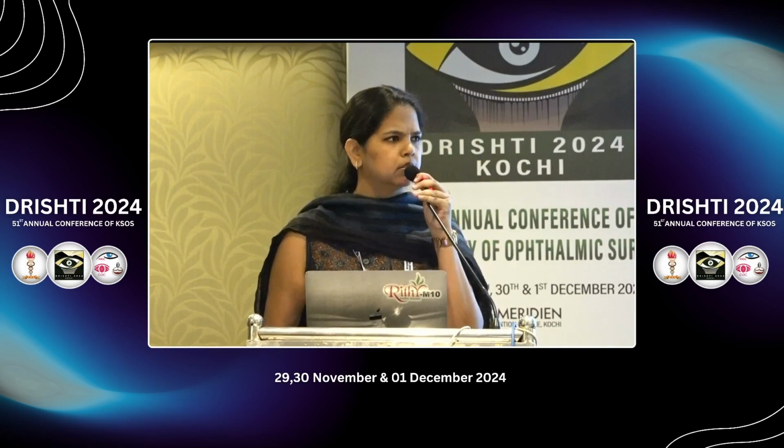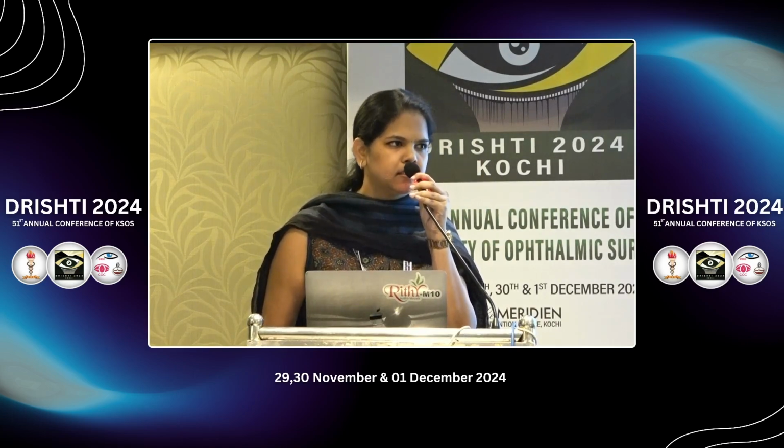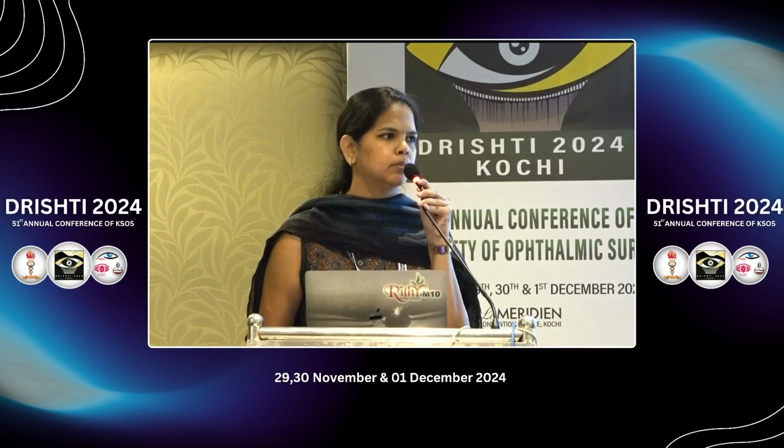No, sir. None of them, because it's a very small duration, sir. Hardly a few seconds, like 15 seconds, 20 seconds, that's how it is. So no vasovagal syncope in any of the 40 patients. The majority were young patients, except for those 14 patients who had post-cataract surgery residual refractive error. All of them were young patients. They were all very comfortable.